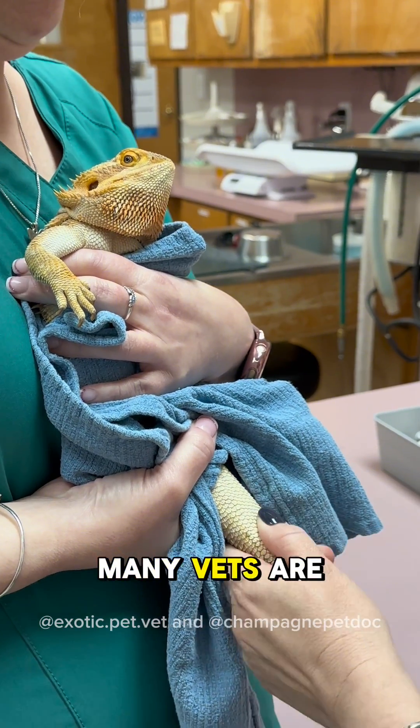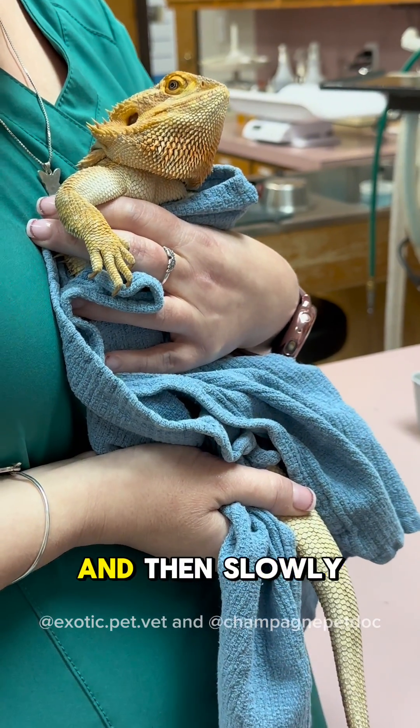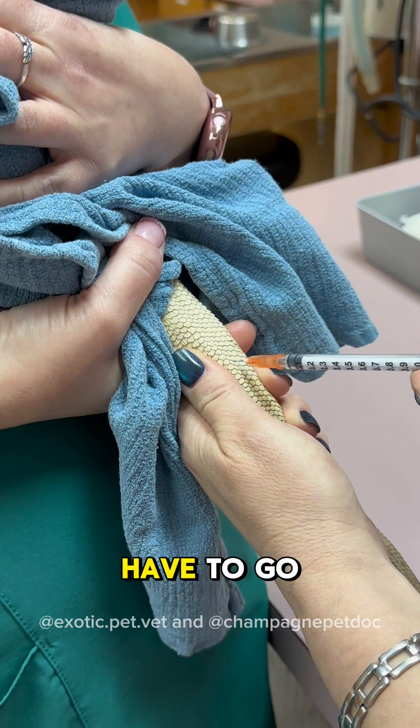This method is similar to how many vets are taught to draw blood from cattle, where you advance until you reach the vertebral process and then slowly draw back. Though if you go slowly until you see a flash, you don't always have to go that far.